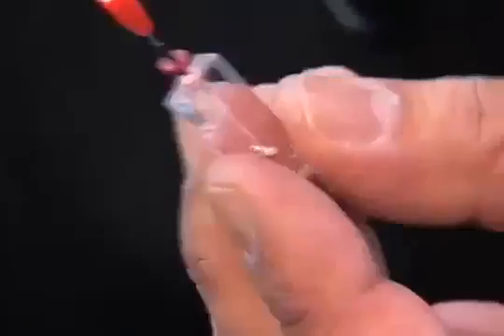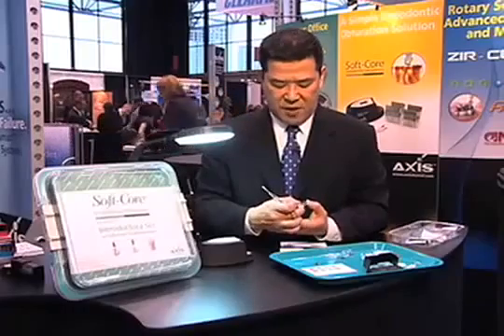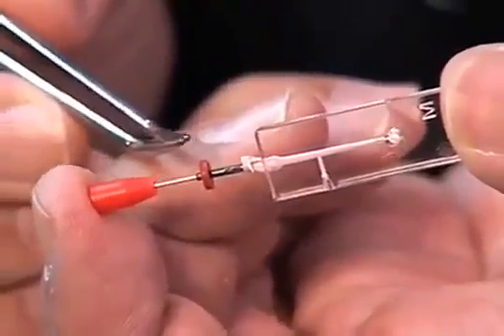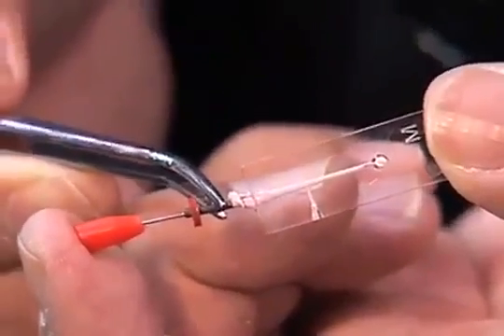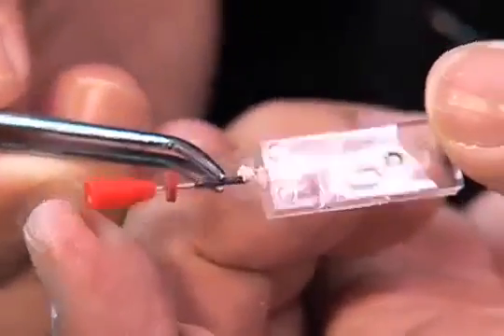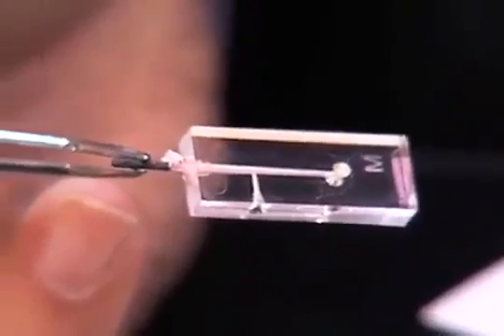I'm going to show you how to remove the pin and the rubber stop. What I'm going to do with my finger is hold on to the end of the handle, and I'm just going to use cotton pliers here to stabilize the core. I'm going to move the rubber stop up. I'm going to stabilize the core with the cotton pliers and gently wind and twist and take the handle out. Now, why I do it this way is so that the rubber stop comes out with it, and it gives you a nice clean view if you're doing multiple canals.